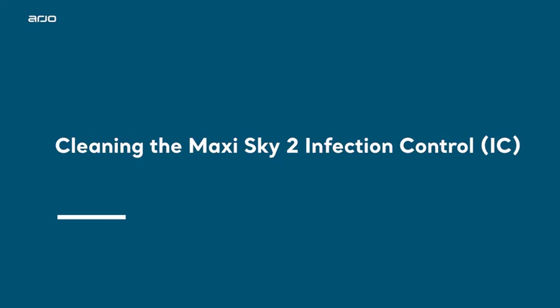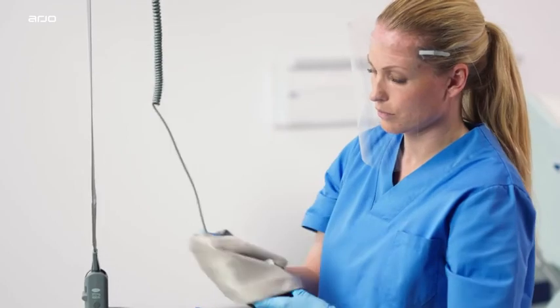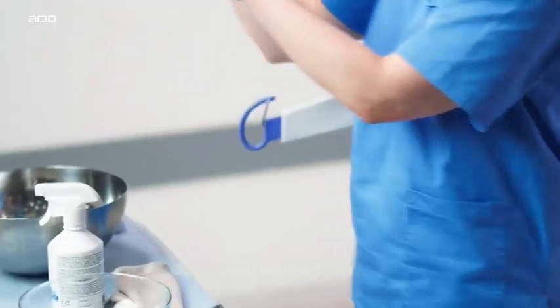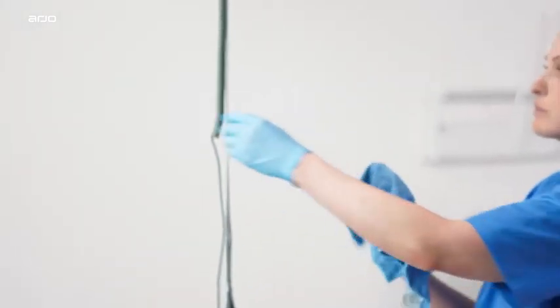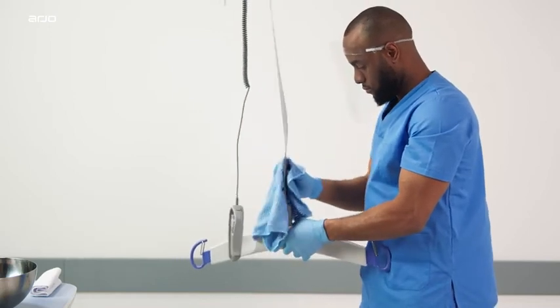Cleaning the Maxi Sky 2 IC. Use a cloth soaked with water to remove excessive residues from the lift and its accessories from top to bottom. Use a damp cloth with warm water mixed with a cleaning fluid. Scrub the equipment from top to bottom to remove any deposits.